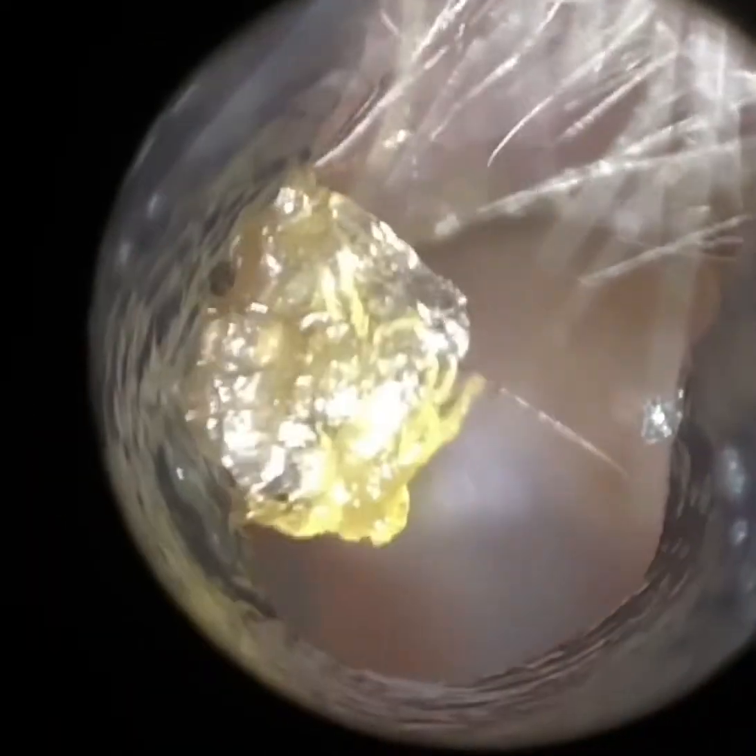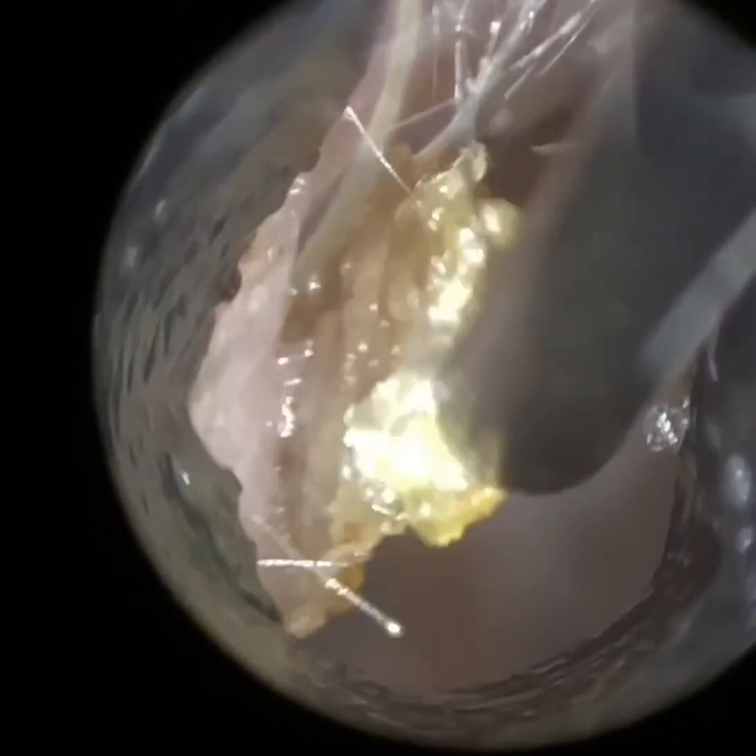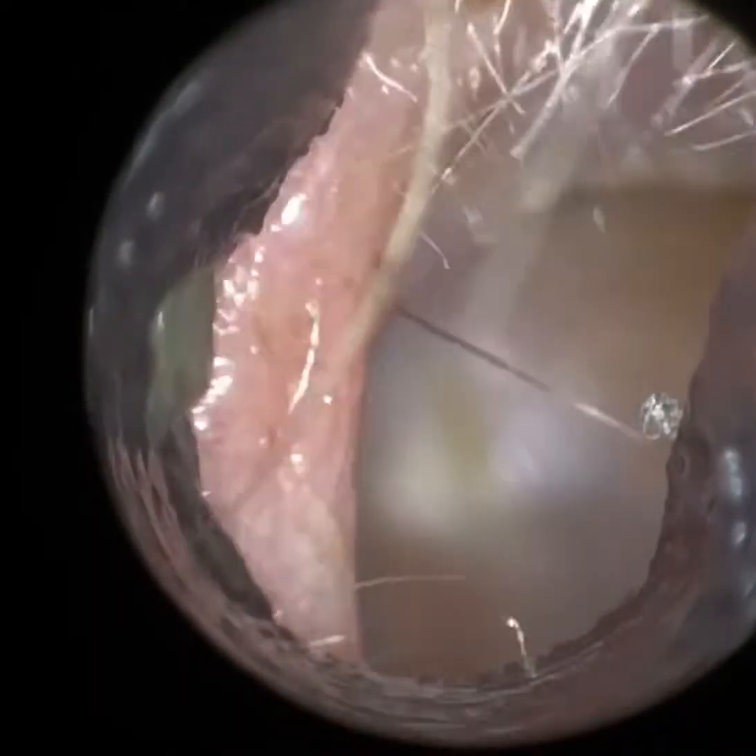I'm going to use a hook just to extract this from the roof — going over and beyond to glide the hook in behind, which I have now done. Then I'm going to bring it forwards gently. And that's the main occlusion removed from the left. We're just going to mop up some dead skin — there's a bit of skin very lateral on the anterior canal wall. We're going to peel this away using the fine end. The last piece of skin does come away — you can see it going all the way to the eardrum. Like the patient's right ear, that piece of skin is very hard and crystallised.